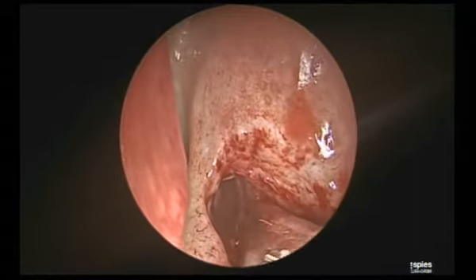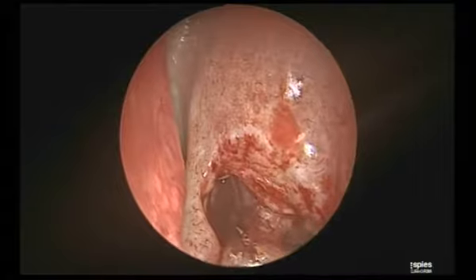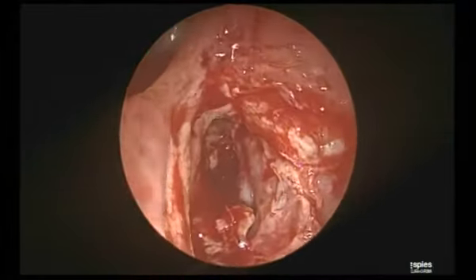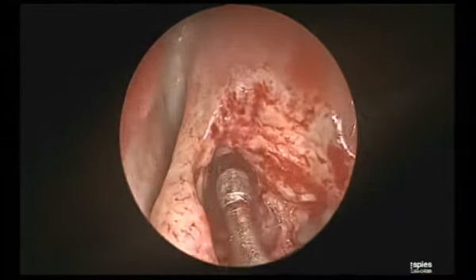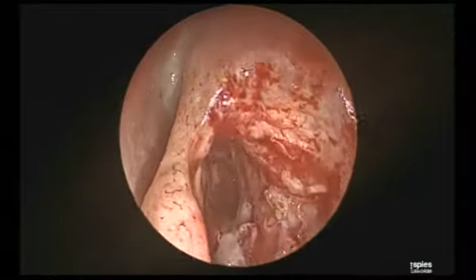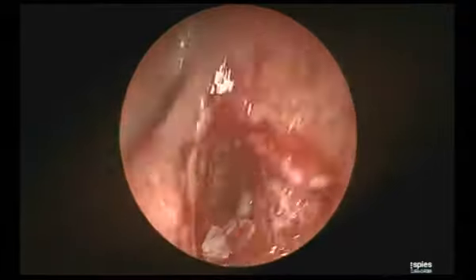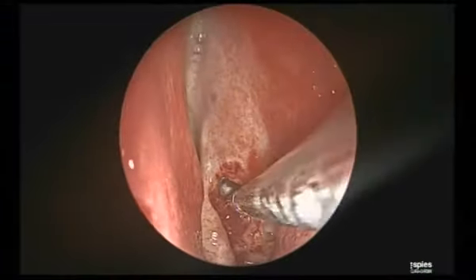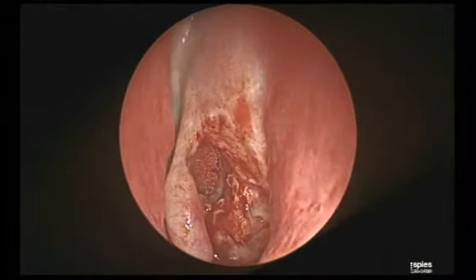Now see my lateral limit after removal of this cell with the microdebrider. Beautiful. Absolutely. Super. Now I see my lateral and medial limits in view. Clear? Now, three borders: medially the middle turbinate, laterally the lamina, and posteriorly the bulla. You see your limits, don't cross these limits and go into the frontal. How can you damage anything in this region? What is the fear?